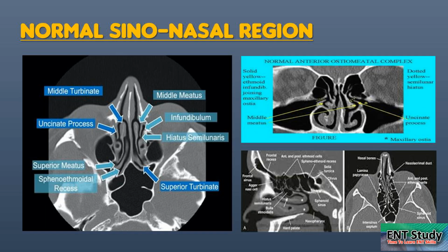We are starting from the top and coming down: the sino-nasal region first, then the pharynx, then the bucco-alveolar region and the larynx. It's going to be quite crowded with images sometimes, but I've made the slides short so that I can speak more.